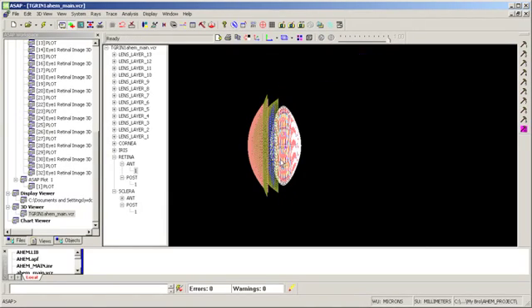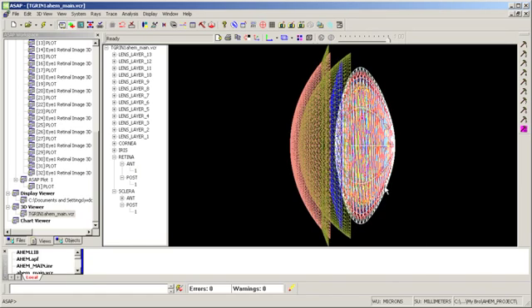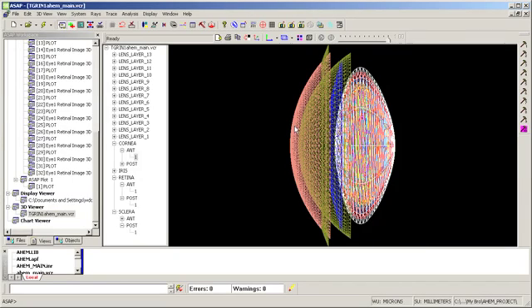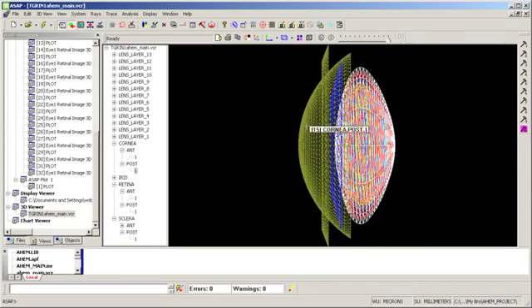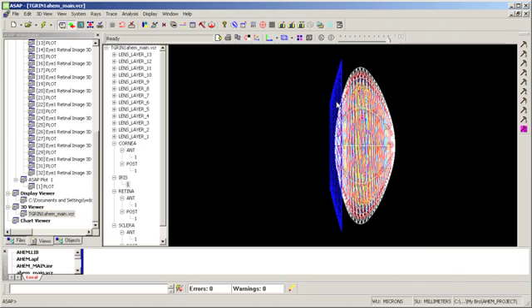And so here we see that onion-shaped eye lens. I'm going to zoom in a little bit here. And I'm also going to remove the cornea for viewing some of these and the iris.